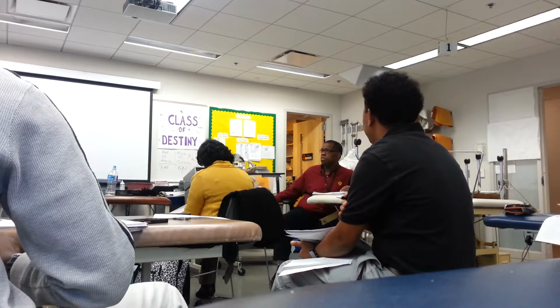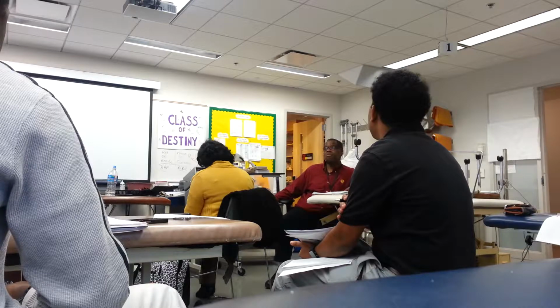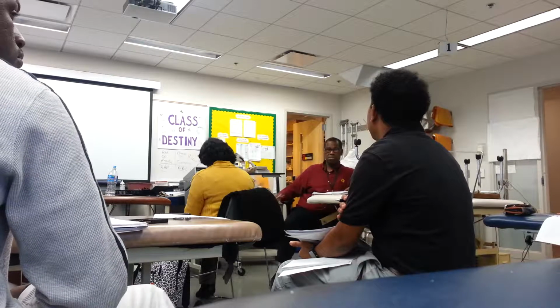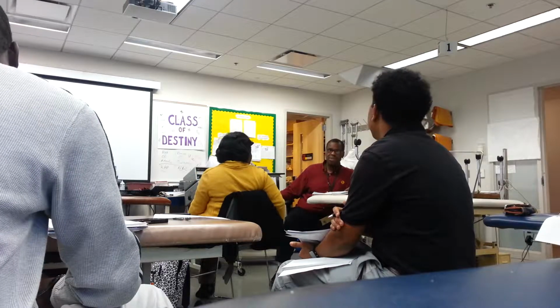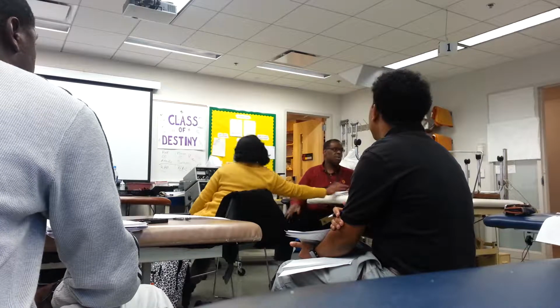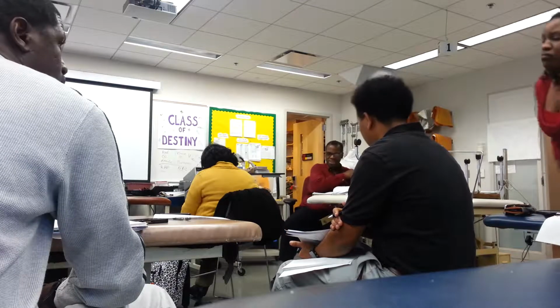Let's say I want to paint this room. I can't paint this room right now. Too much in here. So the first thing I'm going to do is clean out everything. Wash down the walls. Then I'm going to paint it. So the first thing you're going to do is kill out all the bacteria first. Then start helping with building up the granulation. Next page.